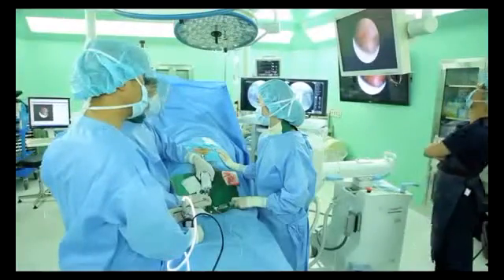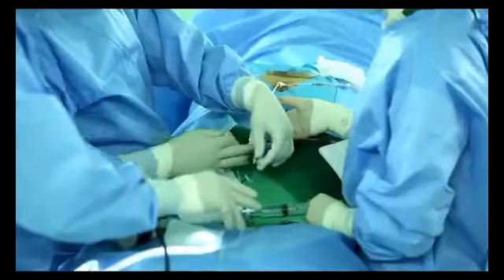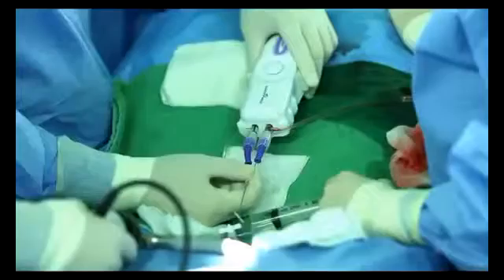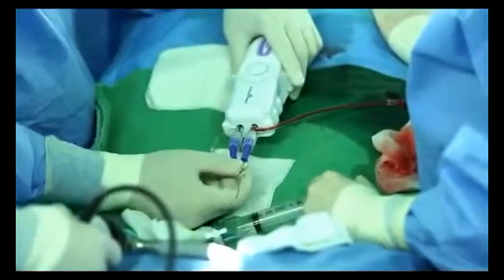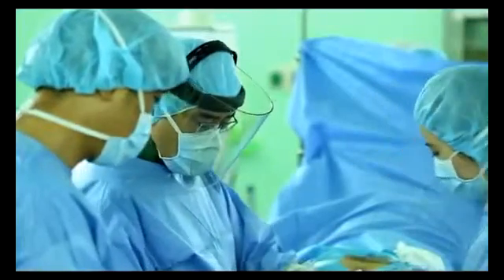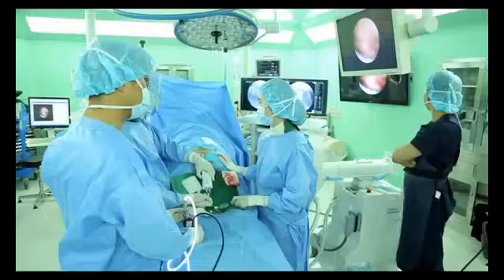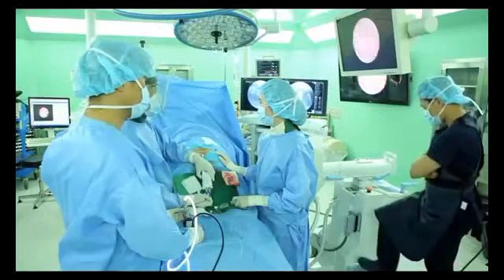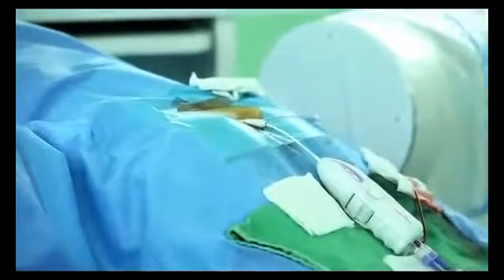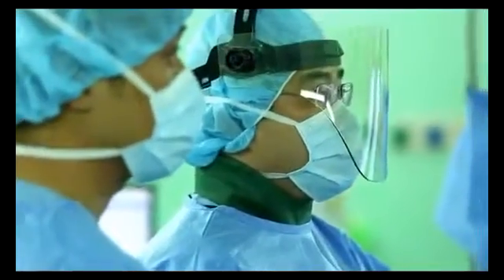This procedure is almost finished, but you're wondering when to finish this procedure. SELD procedure time fully depends on the SELD surgeon's experience because SELD is a concept of decompression, not total removal of HNP, such as PELD and open discectomy. You should ask the patient before SELD if the patient has pain in the operative position, and it will help you to judge when you should finish SELD if the patient has pain.